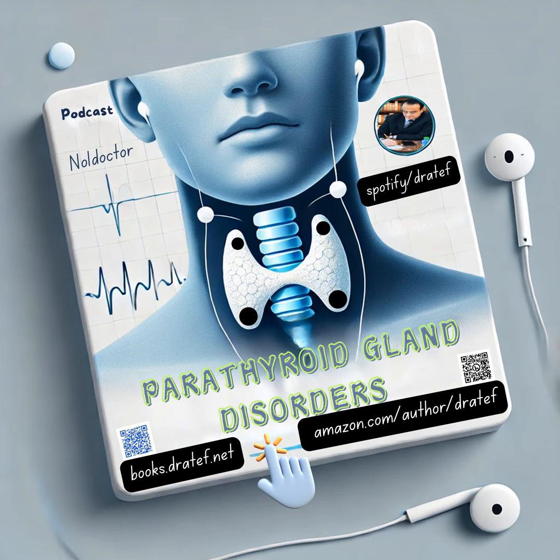How does that work? The second approach is called the normal range protocol. Ooh, intriguing name. Lay it on me. In this one, the surgeon takes a blood sample before the incision, removes the suspected gland, and then waits 10 to 20 minutes before checking the PTH level again. So, a bit more waiting involved with this one. This time, they're looking for the PTH to not only drop, but to actually fall within the normal range. Ah, so it's not just lower. It needs to be back to where it should be. A double check system. I like it.